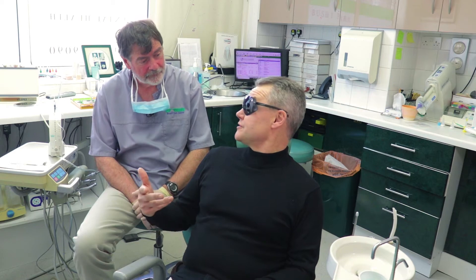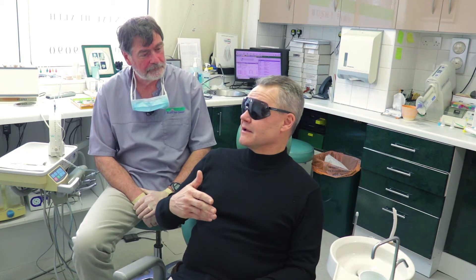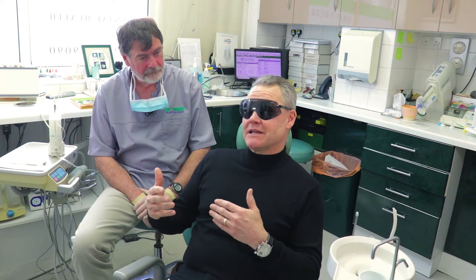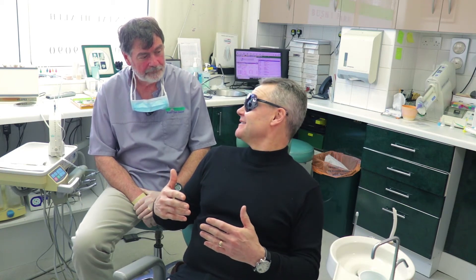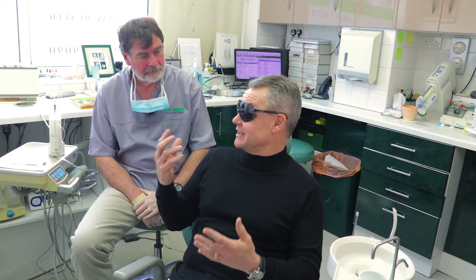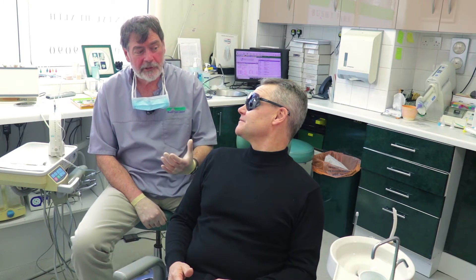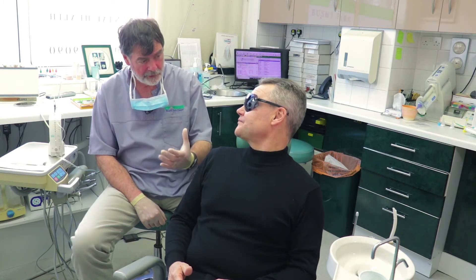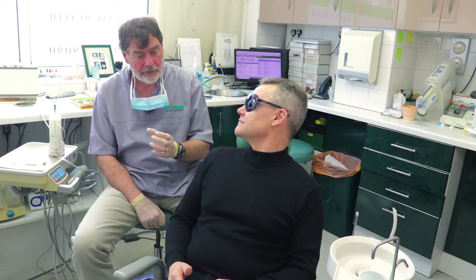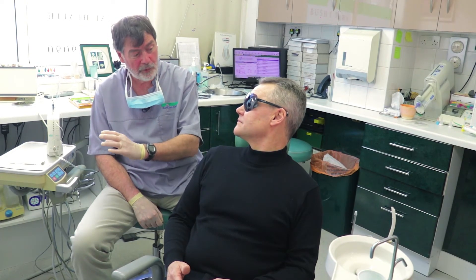I'm not nervous, never have been afraid of needles, I've felt no fear of needles. But that was absolutely painless — and not just painless, I actually didn't feel it, which is unusual. I've had lots of injections and you do feel a little scratch, but there was nothing there — it's really good. Your appointment today is for two and a half hours because we're doing two crown preps and a filling on this side. So I don't want this two-to-three minute process to dictate the entire appointment.